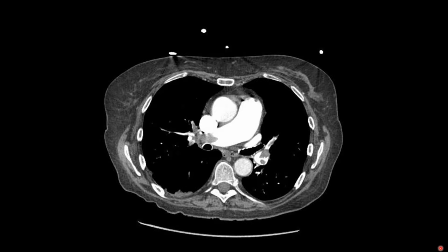And this is just one example of how, without even using the fanciest tools, just detecting that large amount of dead space semi-quantitatively is still worthwhile in terms of understanding your patient's physiology. When I think about end tidal CO2, waveform capnography, whether it's time-based or volume-based, there's a lot of applications that are probably being underutilized. And because time-based is so widely available, I think you really should focus on mastering that as much as possible until volumetric becomes a little bit more user-friendly, widely available, and intuitive.